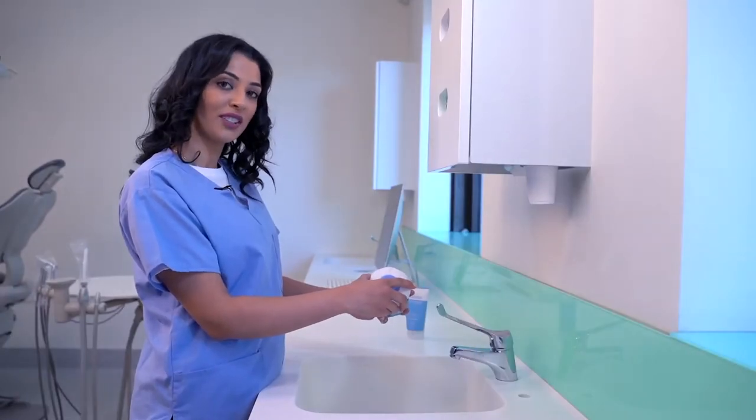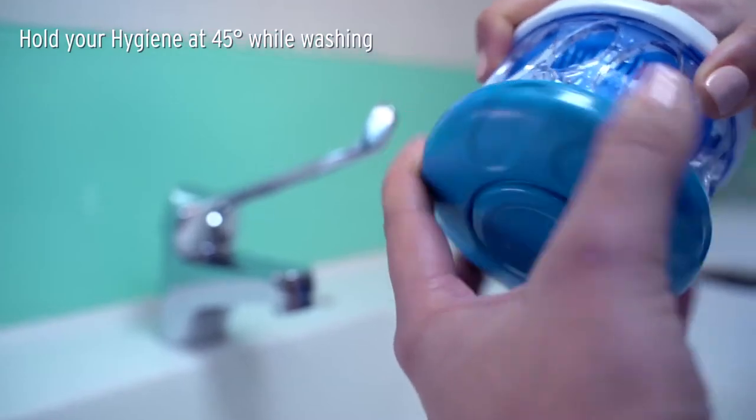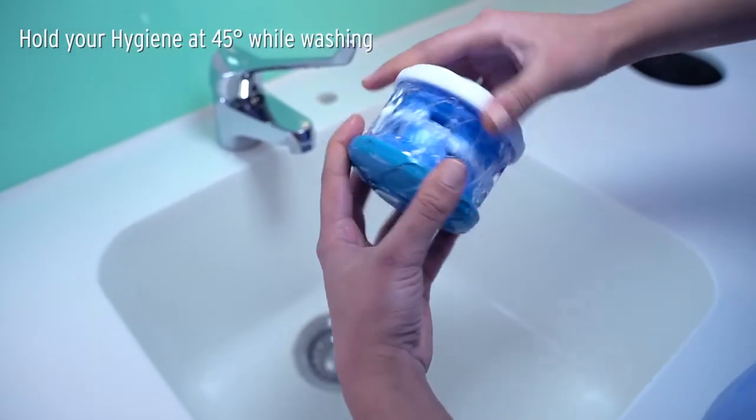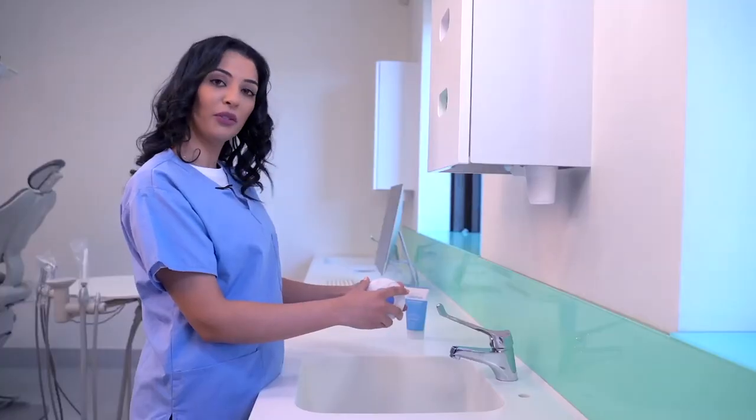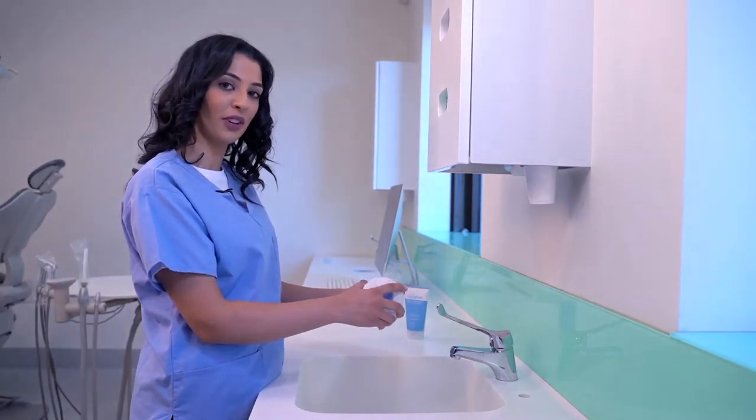There are three washing actions: you can do a top wash, a bottom wash, or a multi wash. Wash for thirty to forty five seconds, or until your dental appliance is fully coated with Dental Fresh foam.